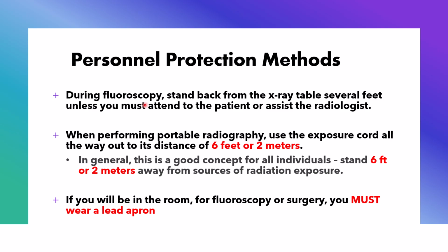Personnel protection methods. During fluoroscopy, stand back from the x-ray table several feet, unless you must attend to the patient or assist the radiologist, and then spend as short a time doing that as possible. When performing portable radiography, use the exposure cord all the way out to its distance.